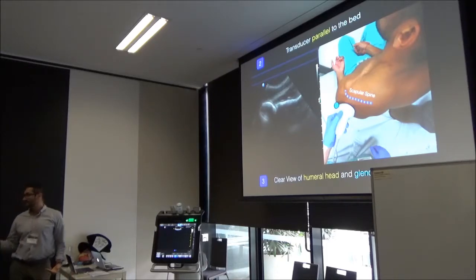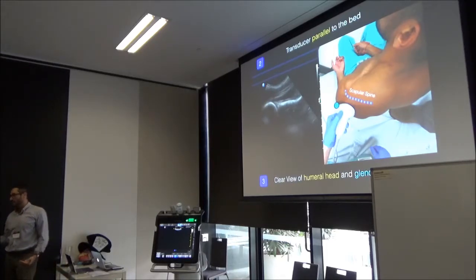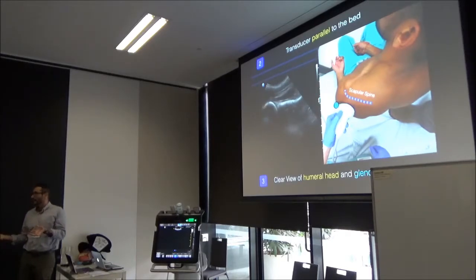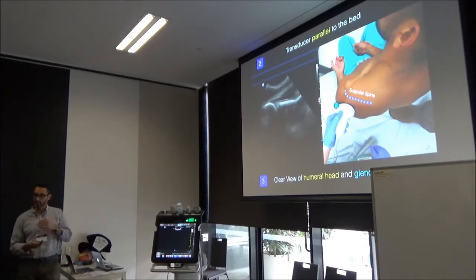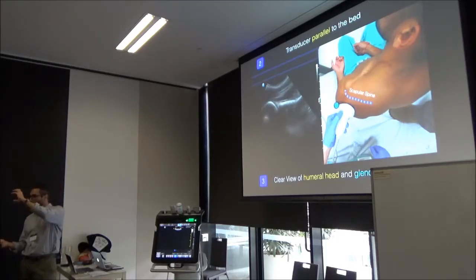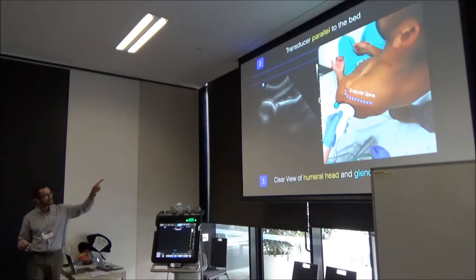If you're articulating your humeral head with the glenoid, you are not dislocated. That's really the key. If I can rotate that ball close to your glenoid, you are not dislocated. Their x-rays look like they're dislocated, but they're rotating, and I'm like, no, you're not dislocated. You just have a large effusion there. It looks like you're almost off, but you're fine. If you can rotate it, you're good.